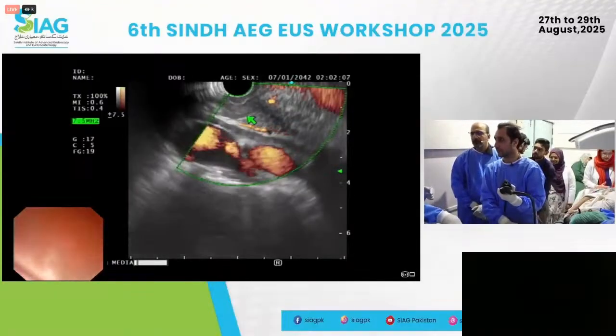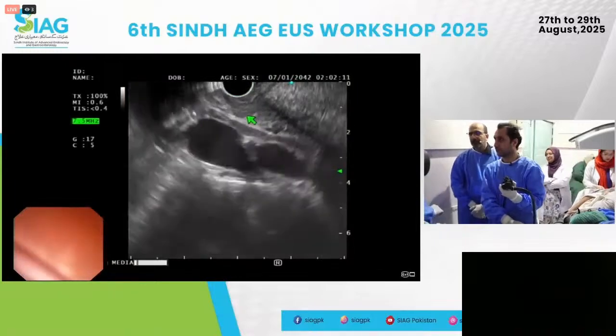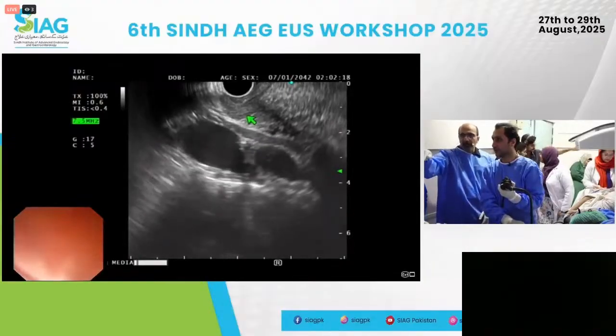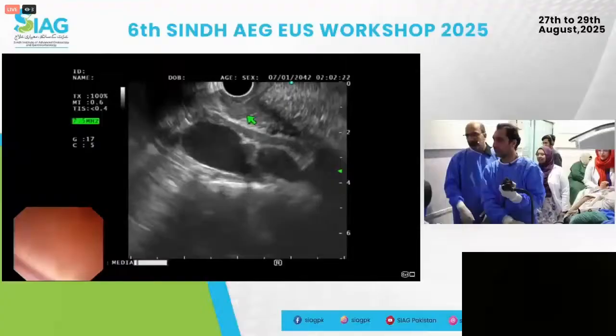Drop it down. So we're just quickly, we're running out of time, but Dr. Jay is just going to look for that second portion view. So there's your pancreatic duct. Pancreatic duct. So now you have to go counterclockwise for bile duct. That's clockwise. Go counterclockwise. Or left.